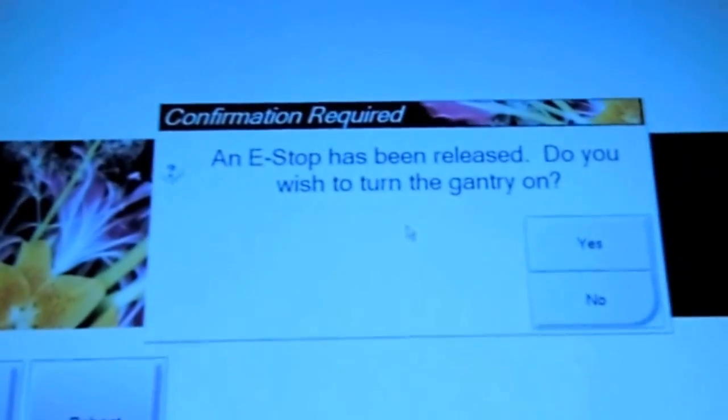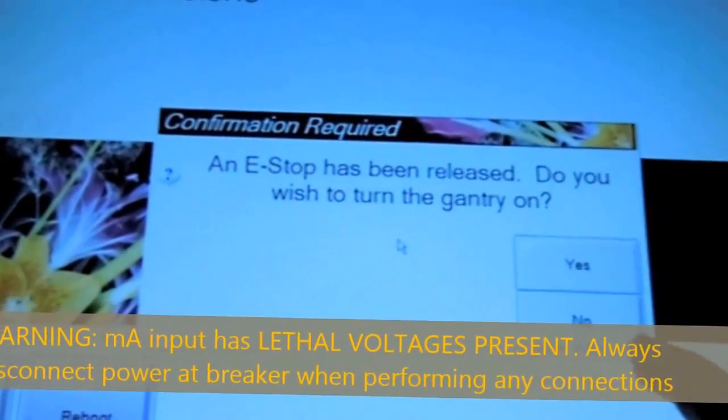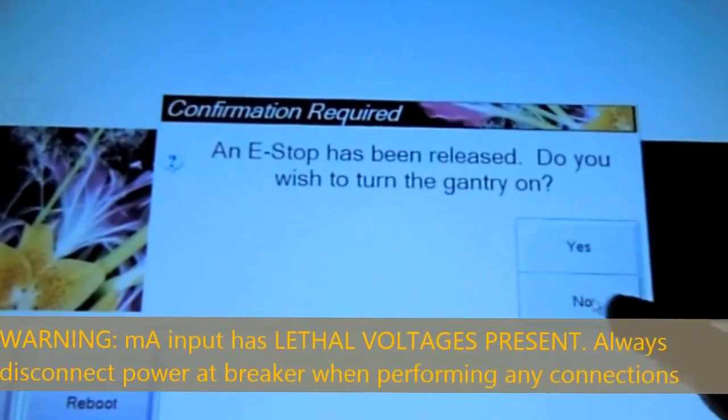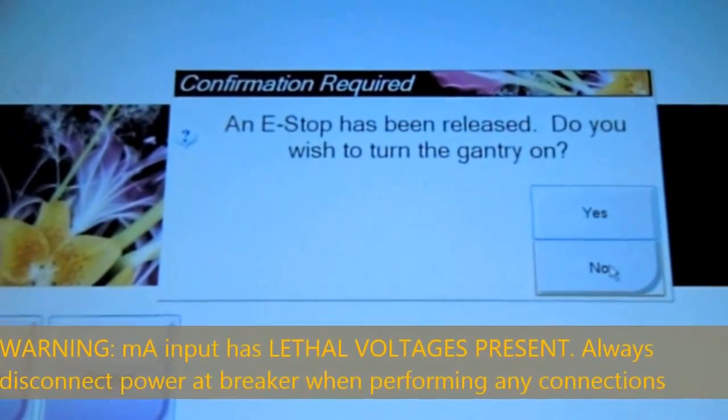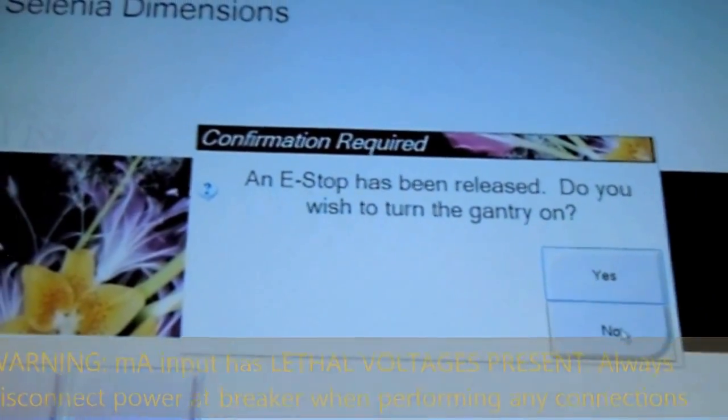Here we're going to shut off the MAMO unit so we can connect the MA. Never want to connect any test equipment while it's on.